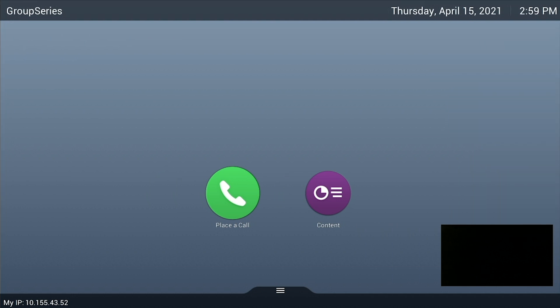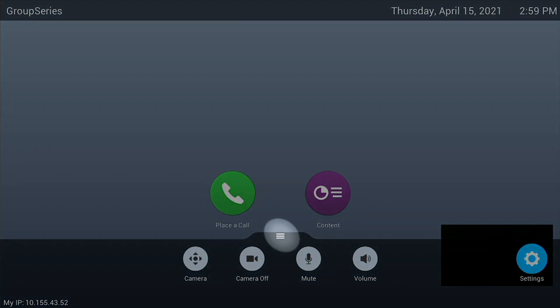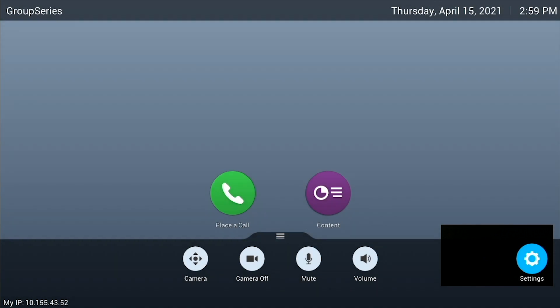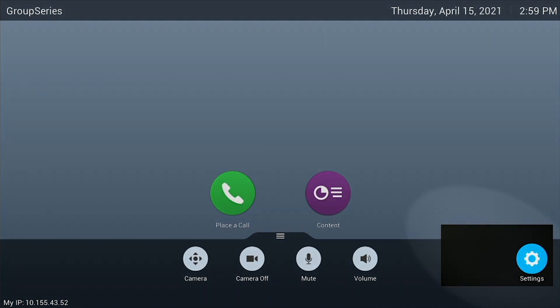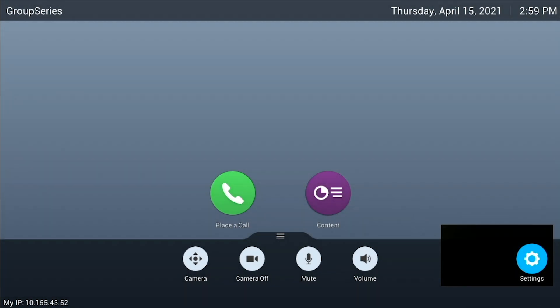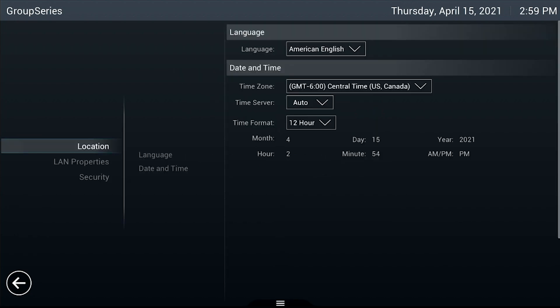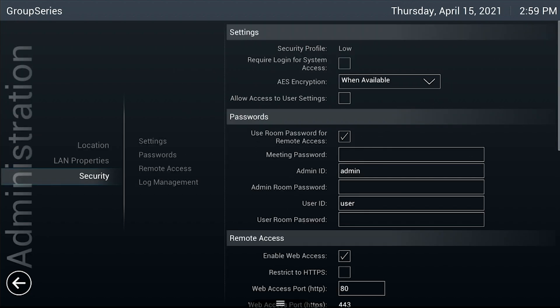On the on-screen menu, tap the menu button, accessed by touching the three lines at the bottom of the screen, then navigate to Settings at the bottom right corner of the screen. Select Administration, then Security.